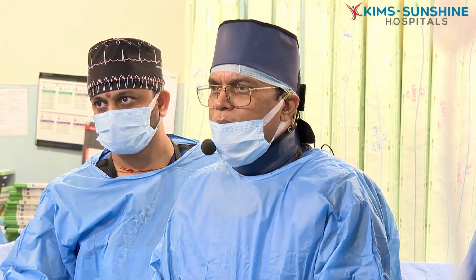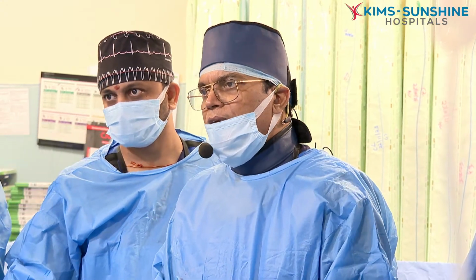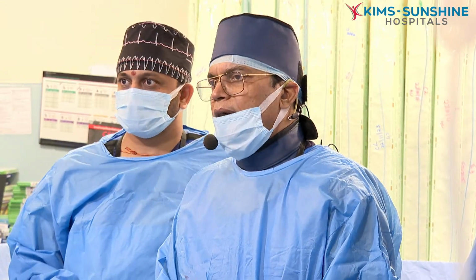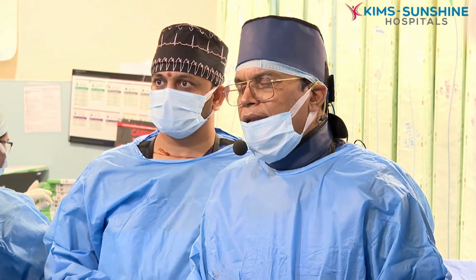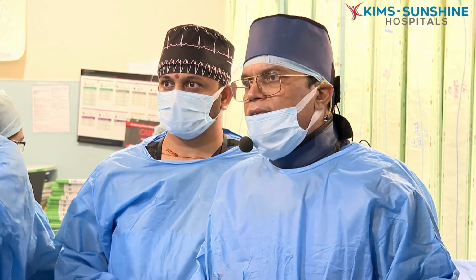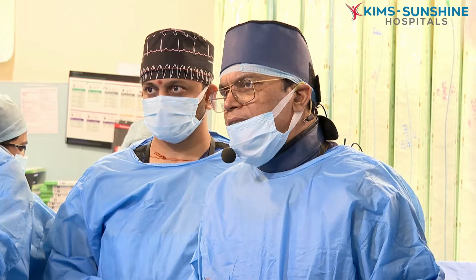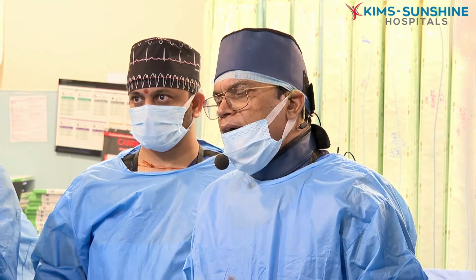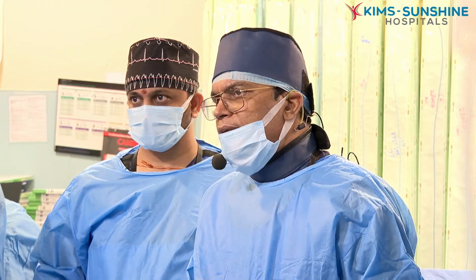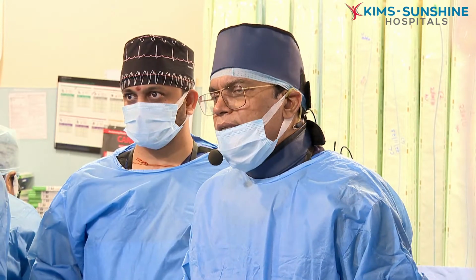We will share that. That is also a very long case, but I think with this note, because imaging is very useful in left main bifurcation optimization. Why? Because even if you see the recent data like the IVUS-XPL study, ADAPT-DES study, or Ultimate study, all these studies have shown the MACE rate with imaging reduced by almost 50 to 60%, including sudden death, stent thrombosis, and TLR.